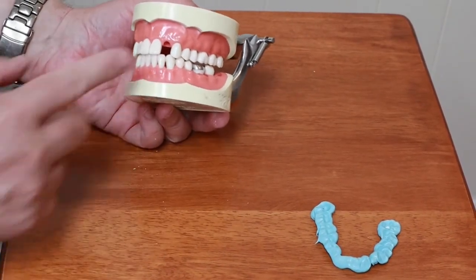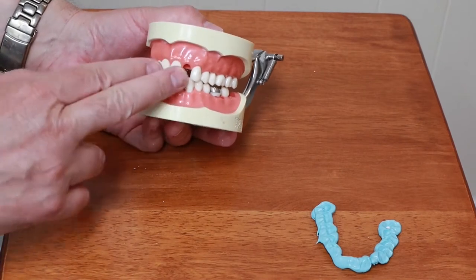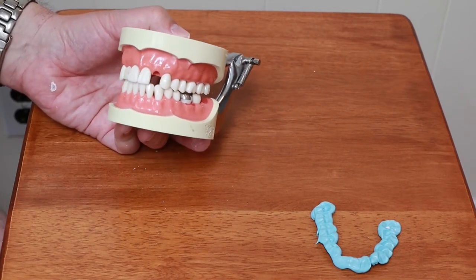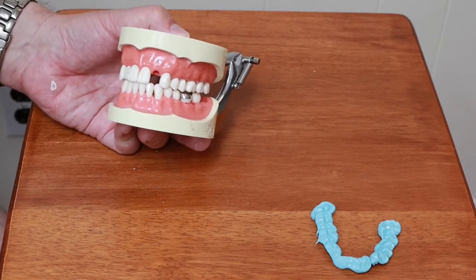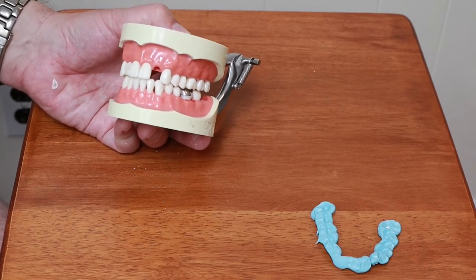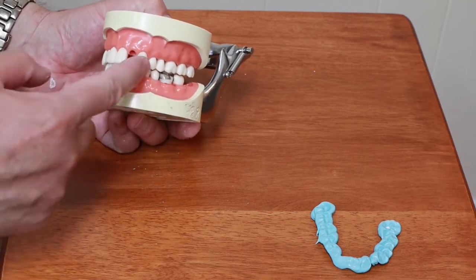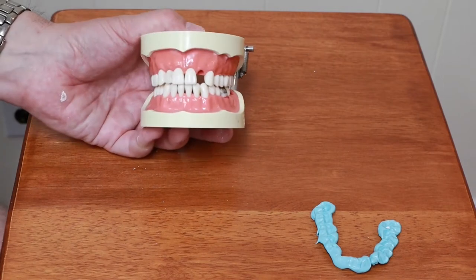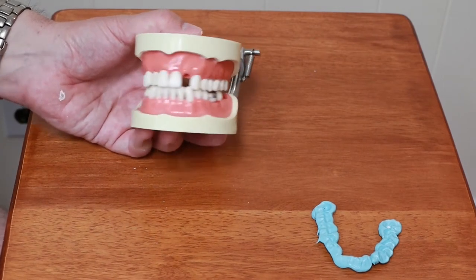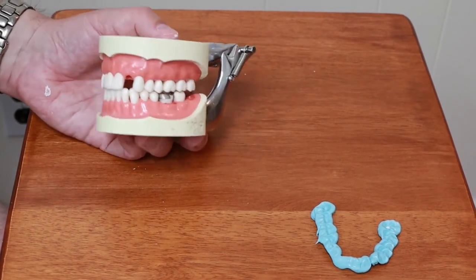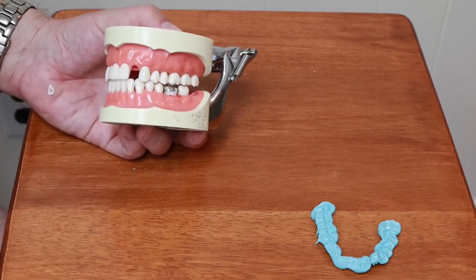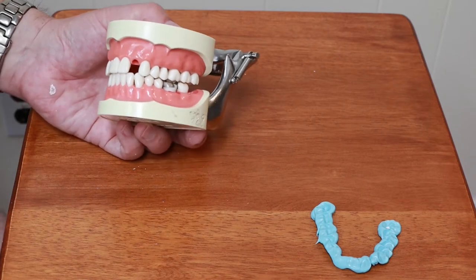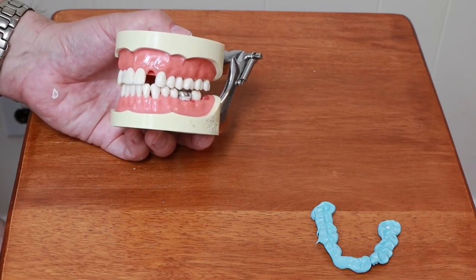We'll also pick a color for the missing tooth. Since these are just plastic teeth the lab's not going to be able to match them exactly since they're used to matching human teeth. So if this was an actual live person we'd match the teeth. I would take multiple photographs too. Both of the teeth on either side. Take some smile photographs so they know how much of the tooth shows.